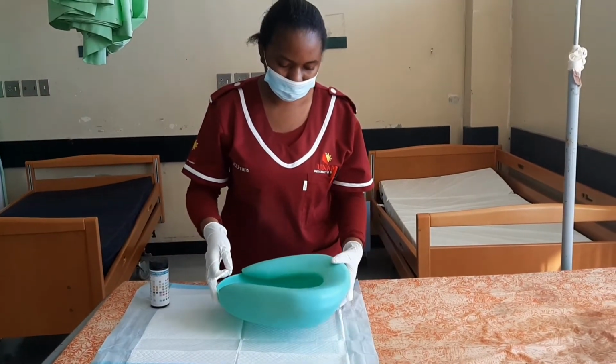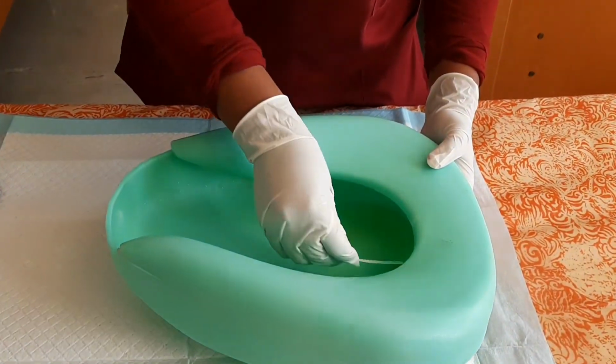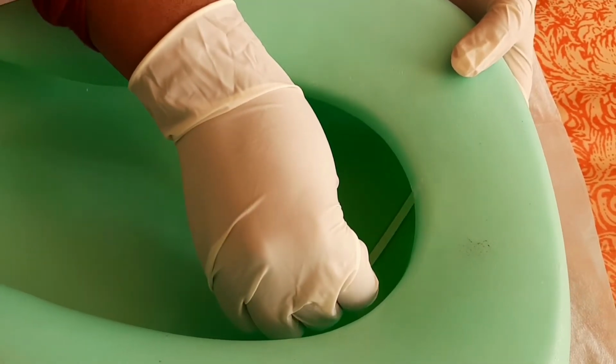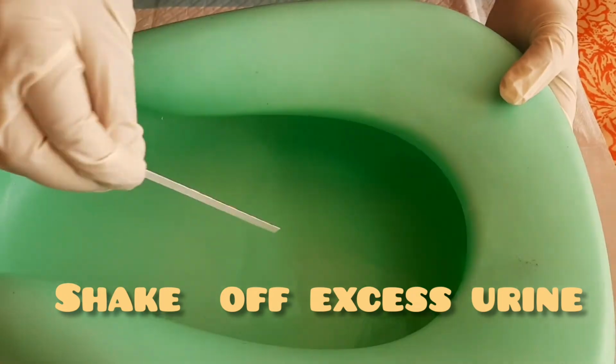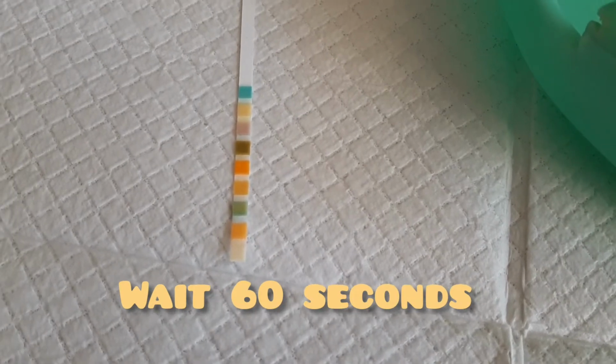And then we dip it in everything. There we go. You shake it a little bit, and then we wait for about 60 seconds before we can check the findings.